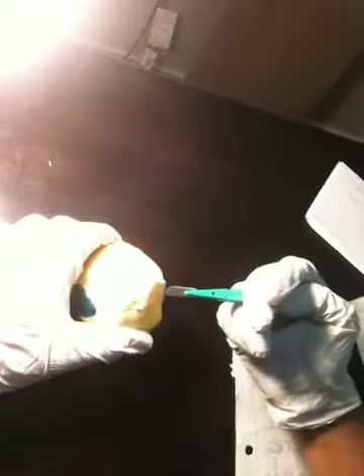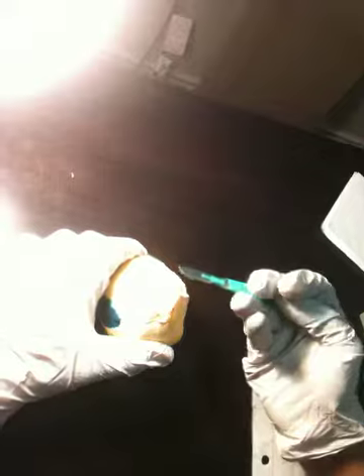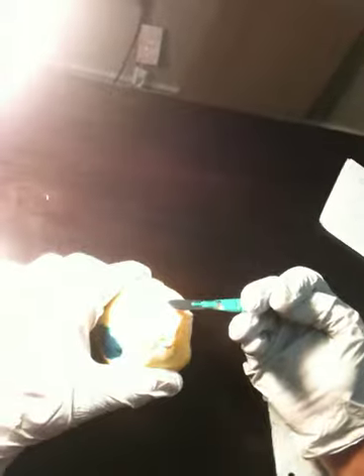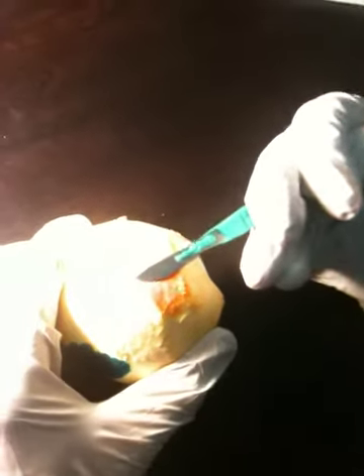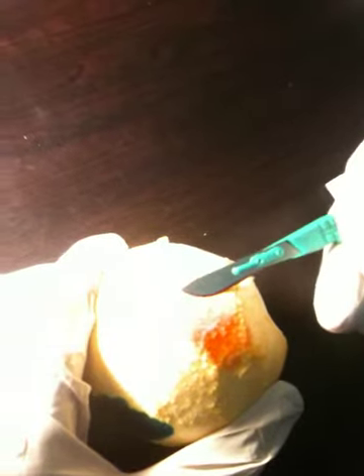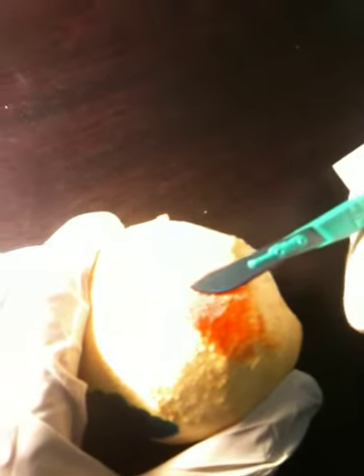So we're going to take a scalpel of 10, grabbing it with the third and fourth finger, and forearms in a supported position. We're going to go parallel to the surface of the necrotic tissue and try to shave off a little bit, one by one, very little. Don't go deep, just be very superficial. Make sure that you don't go deep.